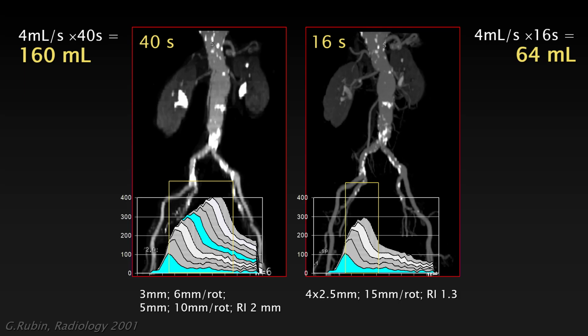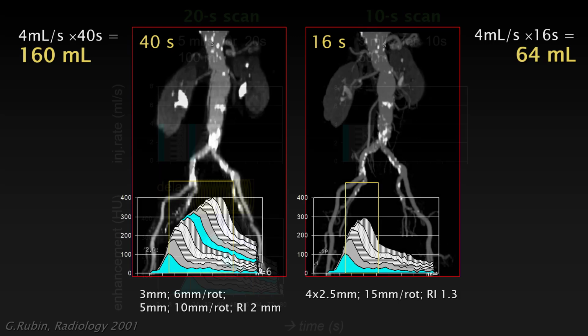We didn't account for the fact that the enhancement is not directly proportional to the flow rate alone, but it also accumulates over time. So once you shorten your injection duration, also your enhancement will not be as good.